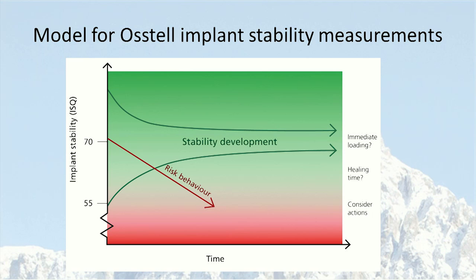And of course, inside this diagram, if we have implants going like that, that is a risk behavior, and then we have to cope with that. And I think Dr. van den Bogarde will discuss that.